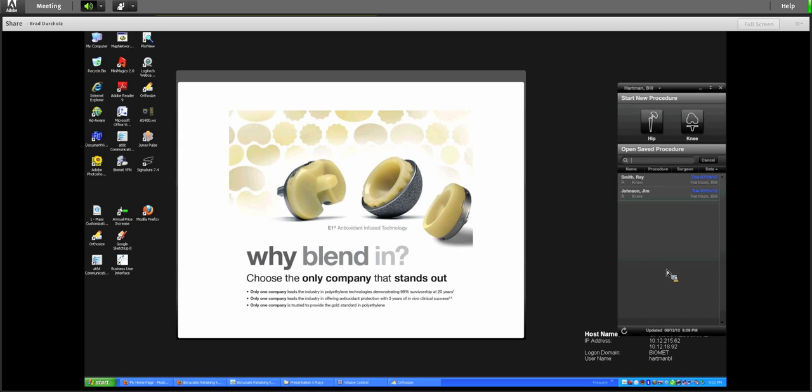So the fact that it's multifunctional already is the reason why the architecture was designed the way it was, so that the cases are all stored in one central location, and then you're able to look at these cases from any location and pull the particular case in at any time from any machine.